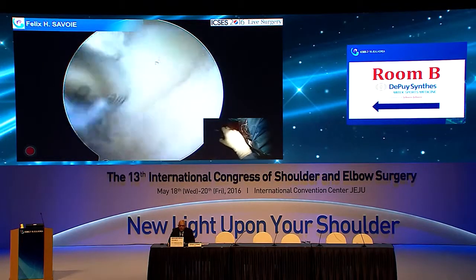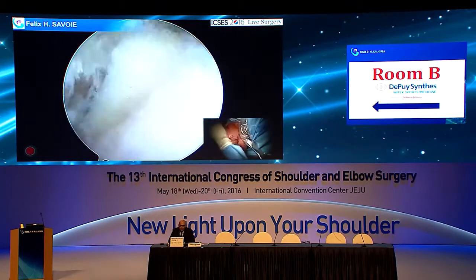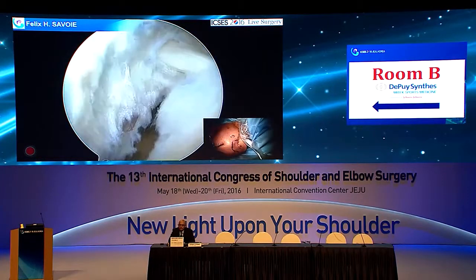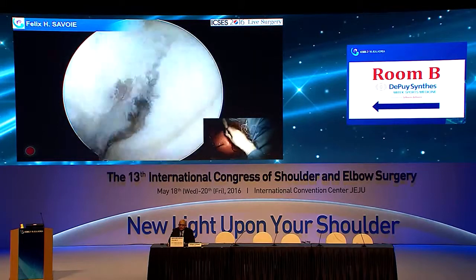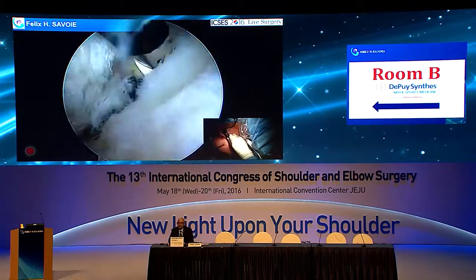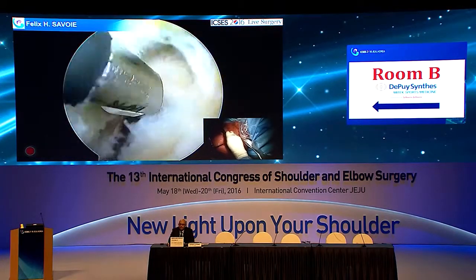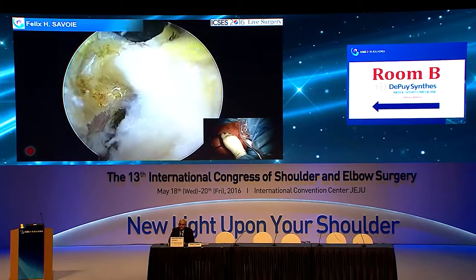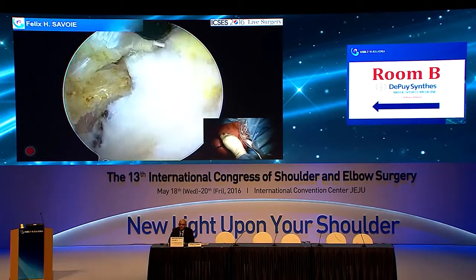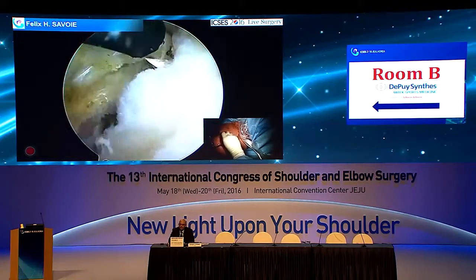Would you have to release it if you had trouble mobilizing this tear? I mean, not in this case. If I was going to have trouble, yes. But releasing the coracohumeral, we'll cut it. So watch what happens. There's no harm in cutting it that I know of. I haven't found any. And so here's our coracoid. If you're going to do an anterior interval slide or a nerve release, you could come past it. But if you think this is a problem, if you think she's dyskinetic, she leans forward too much, there's no harm in just cutting it. It's an accessory tendon, so you're not going to change anything, and it'll help you bring your cuff over a little bit more if you need to.